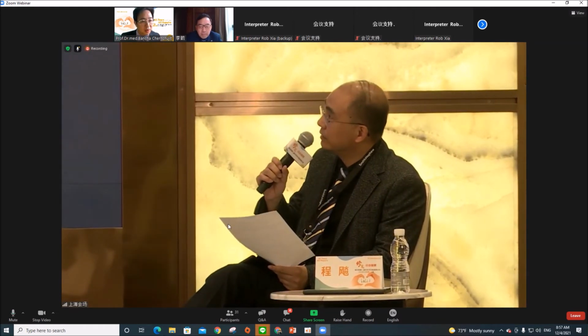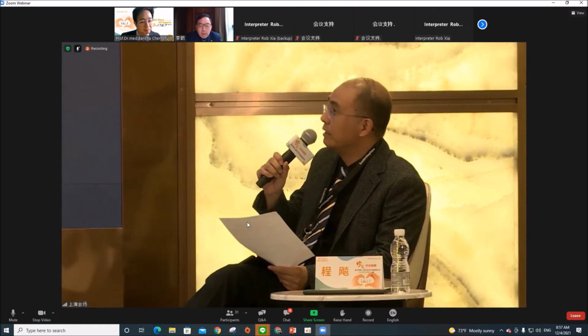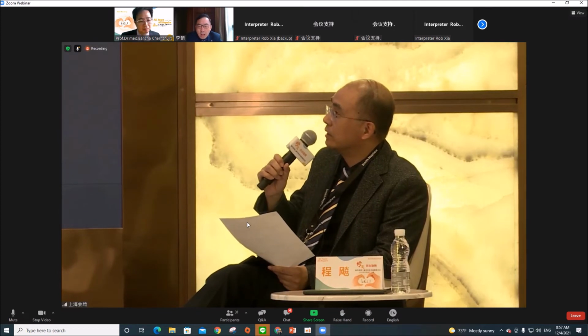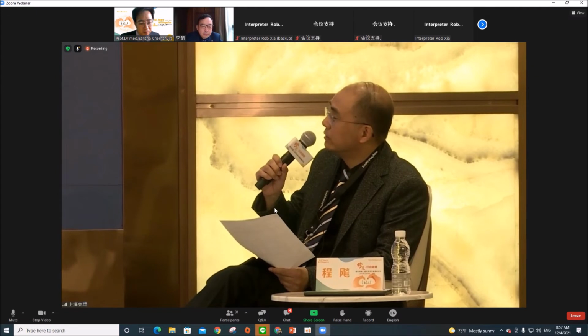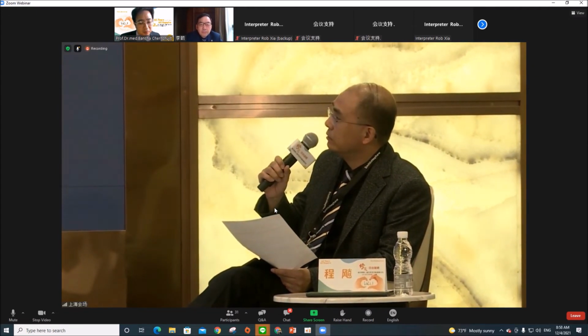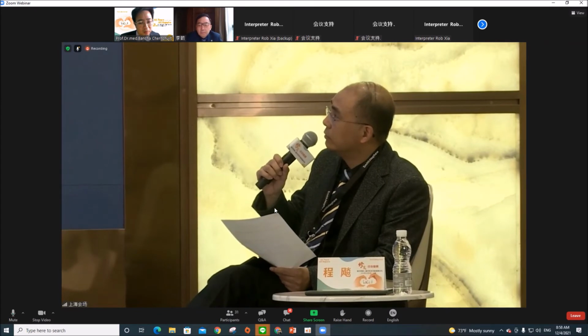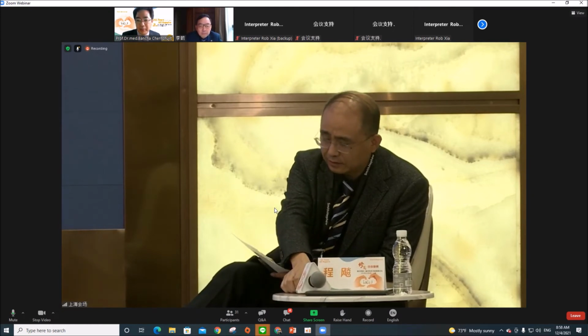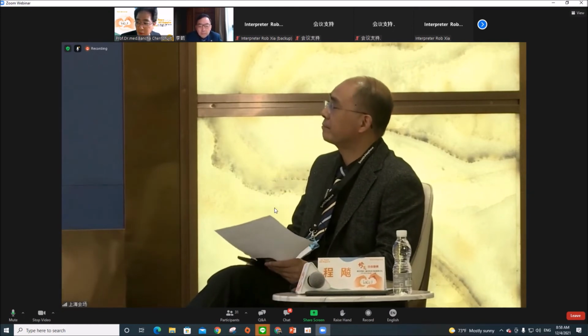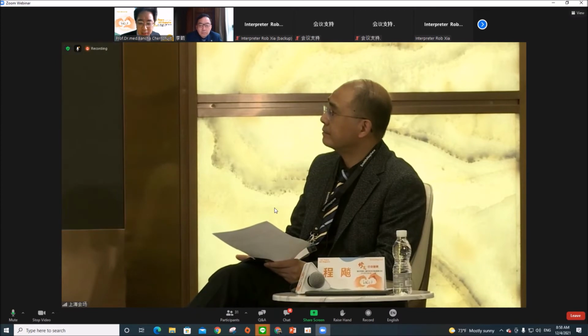Yes, of course. Dr. Bancha, for some of your cases, your posterior root tears, I think you did a great job repairing them. What do you think about the healing rate? Because for many cases, there's still degeneration, right? Right. I think the healing rate depends on the quality of the tissue and the chronicity.